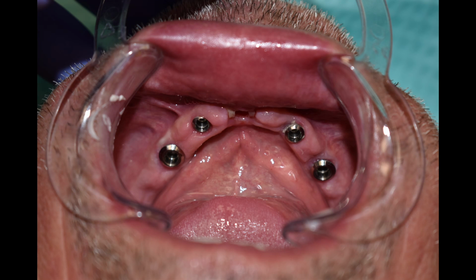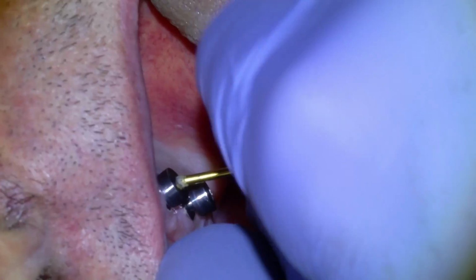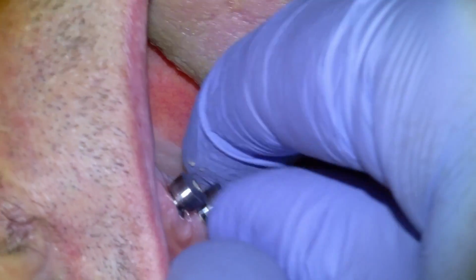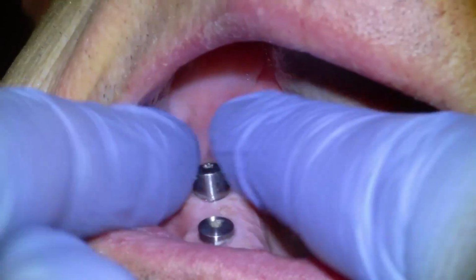So we removed the teeth and placed 5 implants. You can see here's a clinical photo showing the implants in place, and then here's an x-ray and another scan of the implants in place. Surgery went smoothly. We were happy. The implants all integrated well. So we are now going to go over the process of how we make the bridge before we install it.